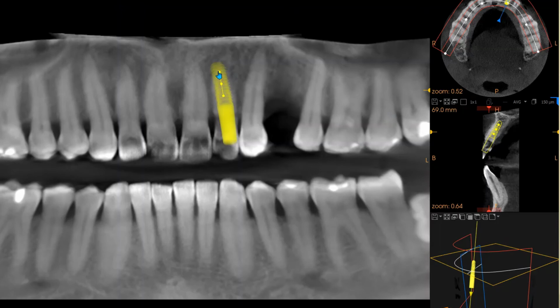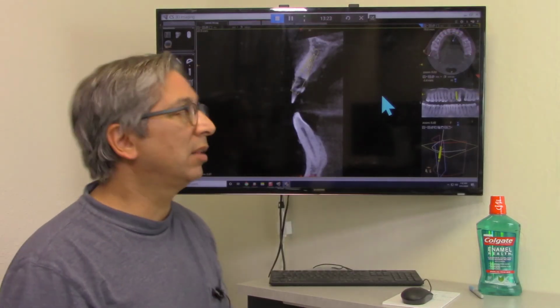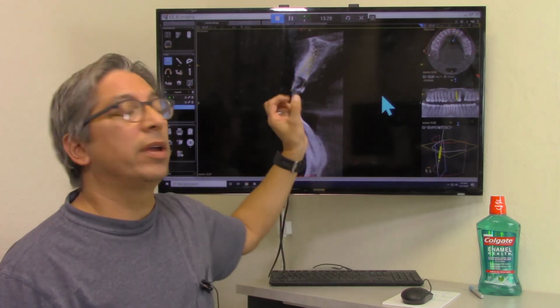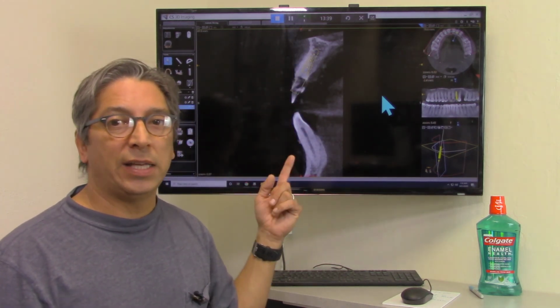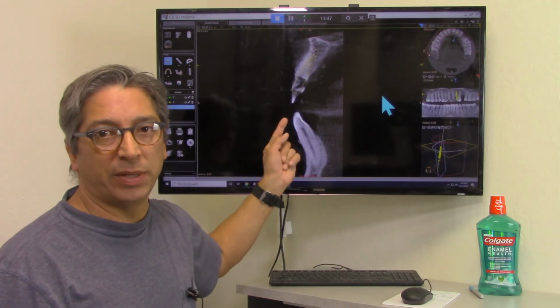But this would be looking at the placement, and I'd probably change this to a little bit of a thicker implant here, just to kind of get a little more stability. You could do something longer. This is an 11.5. You could do a 13 millimeter implant. Length would be good as well. Maybe a little bit wider to kind of shrink out the gap that you're going to find here. You can do a custom healing collar here that will help maintain the tissue, which will help maintain the shape. So this will be a very interesting case to do. You'd get good initial stability, you'd get good placement here. So this could be an immediate placement case here as well.